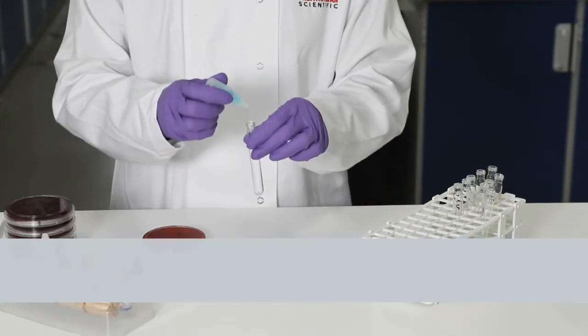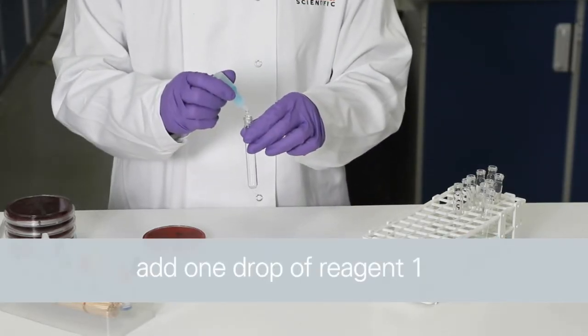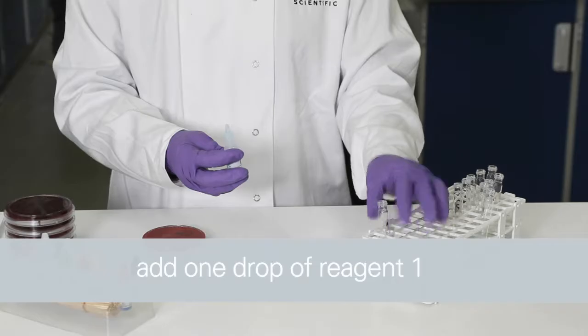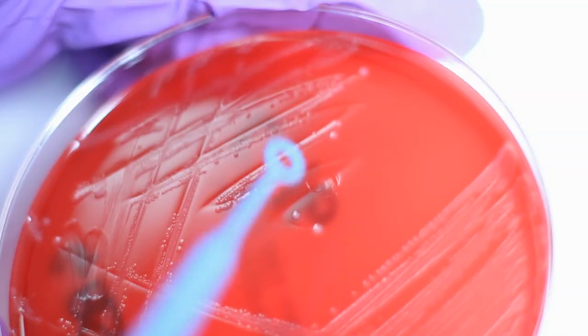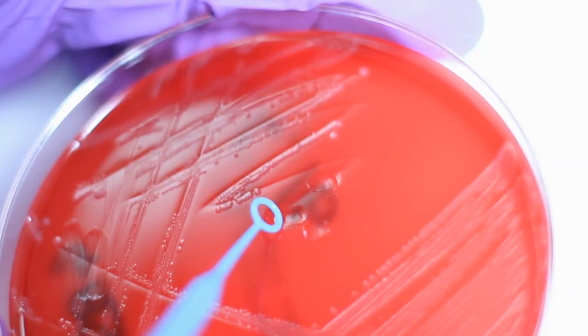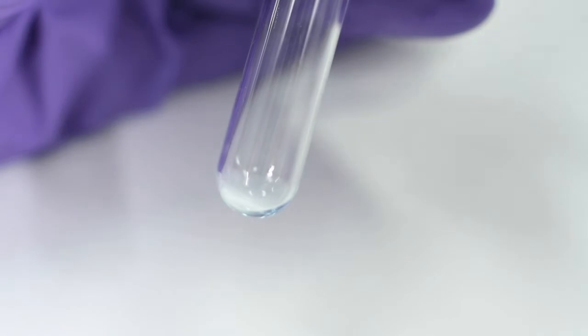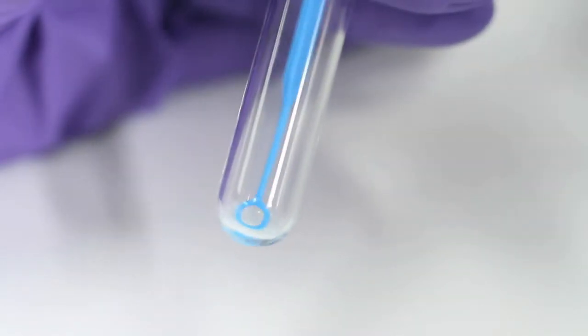Add one drop of reagent 1 to a tube. Choose 1 to 4 isolated colonies depending on colony size and emulsify in the same tube.